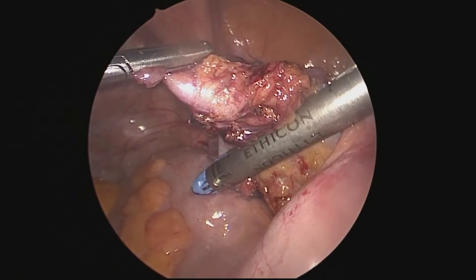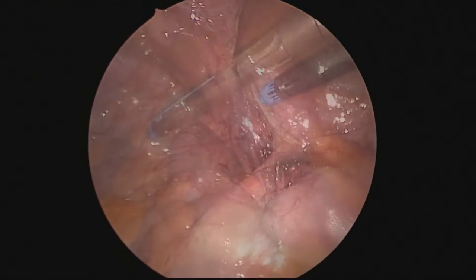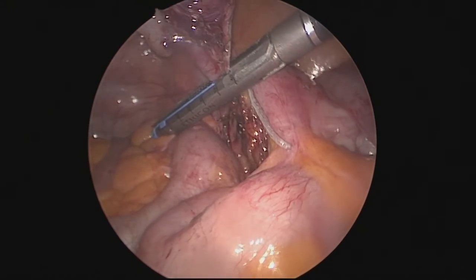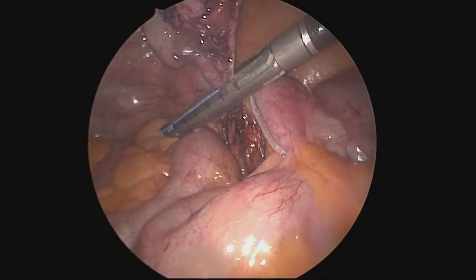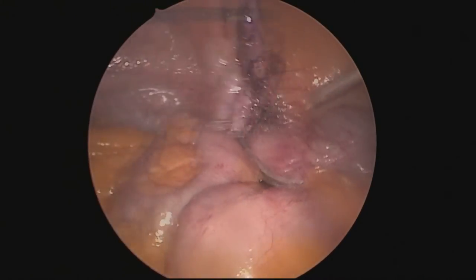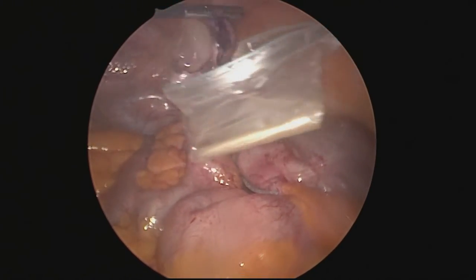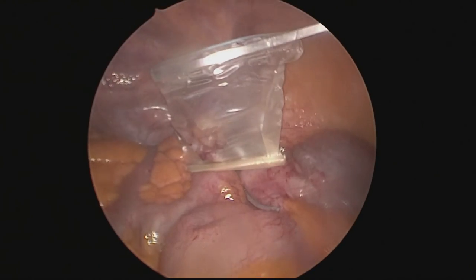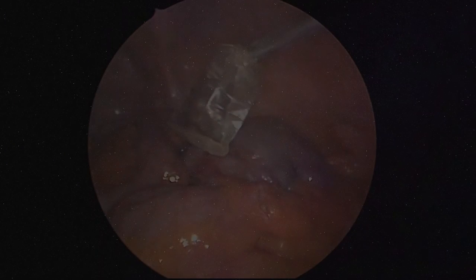The Ethicon GIE stapler was fired across the cecum as well as the appendix. Once this was completed and the specimen was removed entirely, it was placed in an endobag and brought out through the umbilical port. The final pathology, obtained two weeks later, demonstrated a low-grade mucinous tumor of the appendix with low malignant potential.